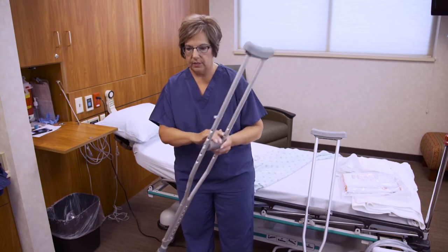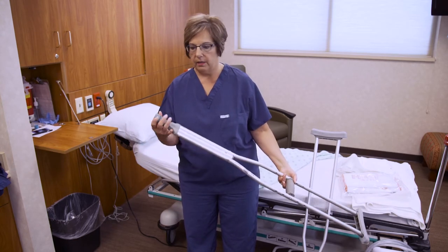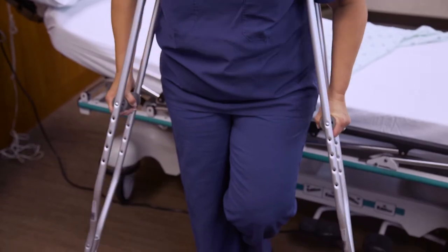When you first receive your crutches, it is important to inspect them and make sure that they are in good working order, with pads, grips, and bases all intact.